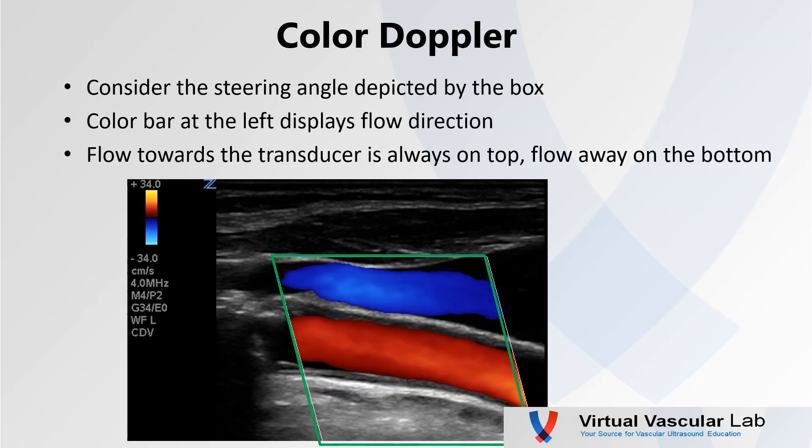Let's consider this color Doppler image of a common carotid artery. The first thing we need to do to interpret it is consider the steering angle depicted by the box, so we know our look angle or angle of incidence is coming in along the arrow. We see the color is red. Looking at our color bar on the left — flow towards the transducer is always on top, flow away on the bottom — we know flow in that common carotid artery is moving from right to left.